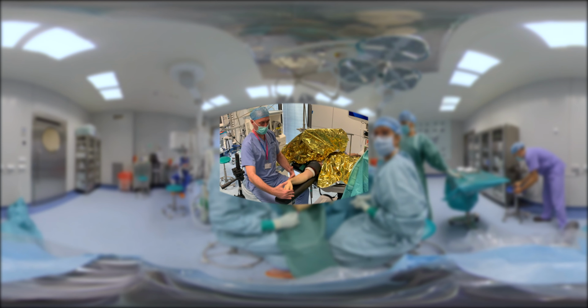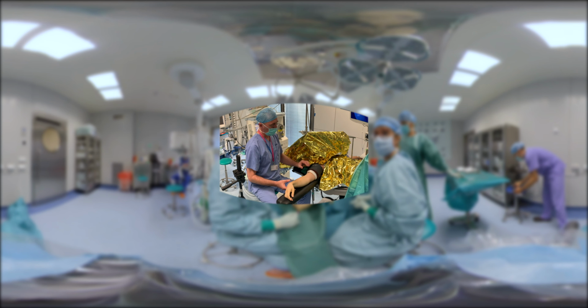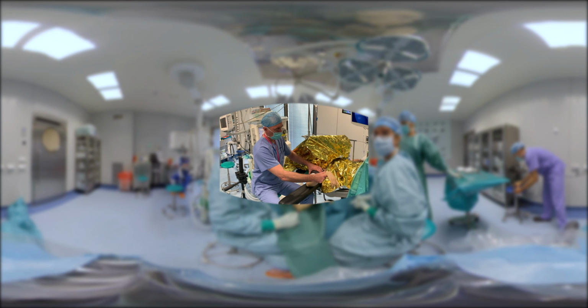Patient is placed in supine position under brachial plexus block. Arm rests on narrow anesthetic support. Tourniquet is on. Shoulder is at the level of the support. This allows for access to lateral, posterior, and medial aspect of the elbow.